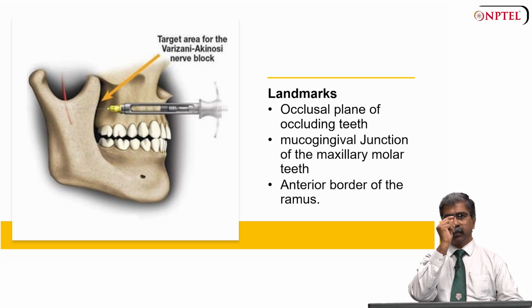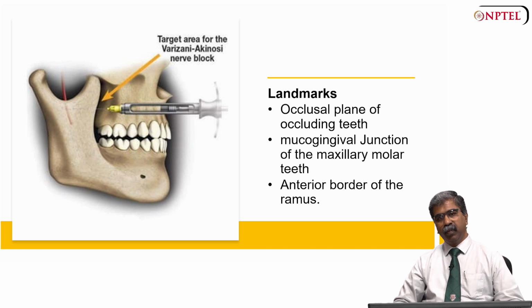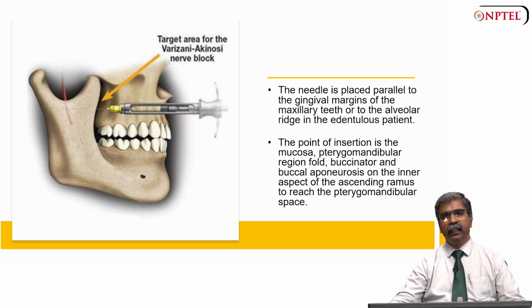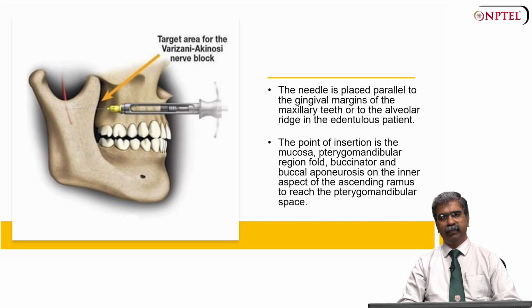What are the landmarks? The occlusal plane of the occluding teeth, the mucogingival junction of the maxillary molars, and the anterior border of the ramus. These are the anatomic landmarks. And the needle is positioned parallel to the gingival margins of the maxillary teeth, or along the alveolar ridge in edentulous patients. This alignment is important for ensuring accuracy of the deposition of the anesthetic solution.